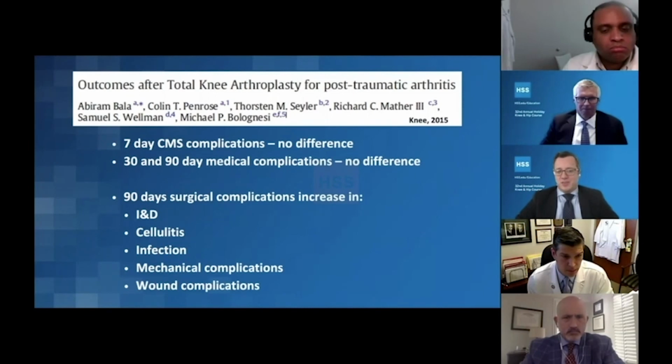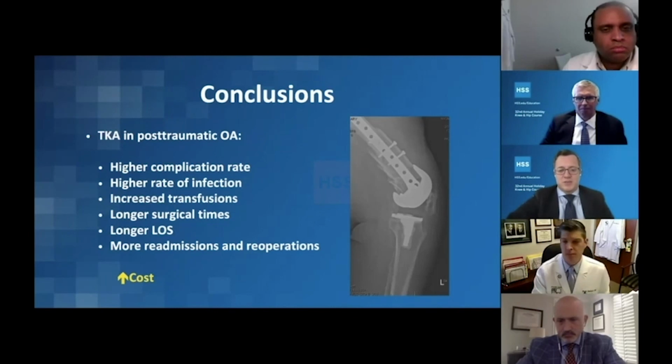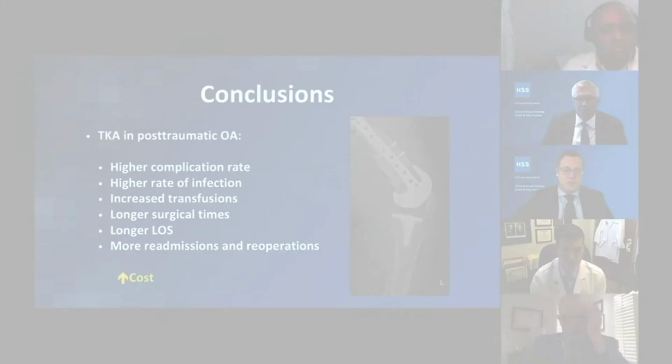I'm harping on this because this is a complex group of patients, and we have to do everything we can to kind of prevent these. So, like I said, total knee in the post-traumatics, higher complication rates, higher infection rates, more transfusions, longer surgical times. Do what you can. A wound vac, it may be more costly, but these patients are more costly over time. So if you can prevent an infection in these patients, it might be worth it. So thanks for your time.